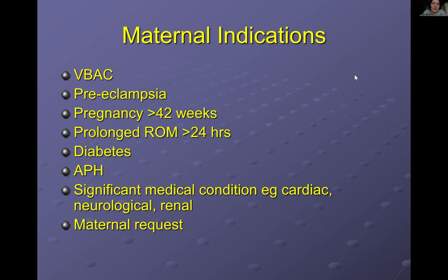And now she's pregnant again, and she would like to go for a normal delivery, then yes, because of a previous cesarean scar in the uterus, that's indicated to have electronic fetal monitoring, of course, because of the increased risk of uterine rupture.